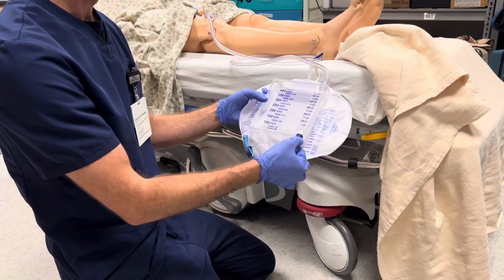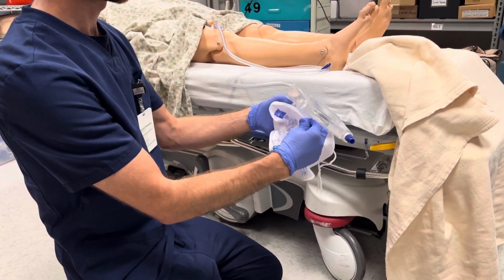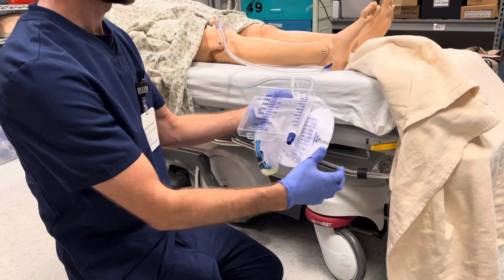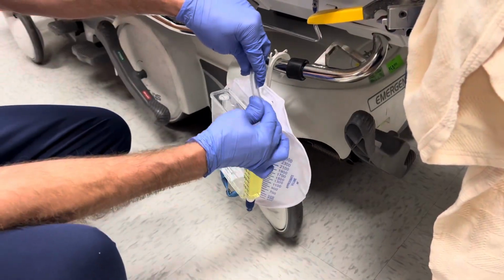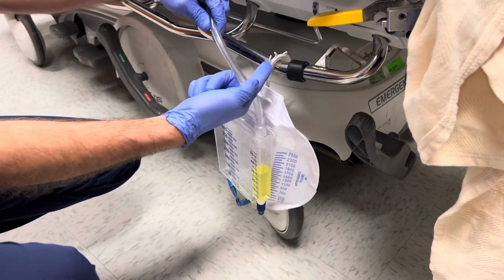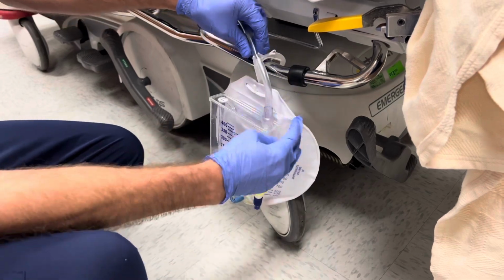A quick tip when inserting a Foley is to first vent it and then separate the layers of the drainage bag. This will break the vacuum, and then go ahead and close it. Verify there isn't a kink at the point where the drainage tubing meets the drainage bag. Some models feature a kickstand, so use this when available to prevent kinking at this site.